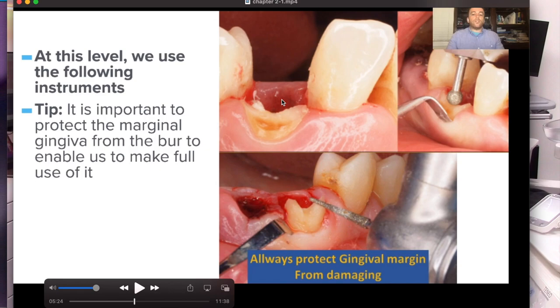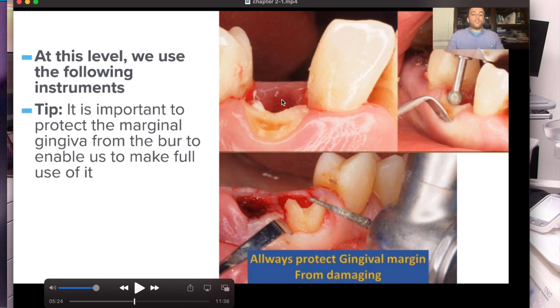If you don't know what partial extraction therapy is, essentially it involves partially extracting teeth, leaving the buccal plate — leaving the buccal portion of the tooth — and then placing your implant. In this video, he goes through a lot of the different, more detailed techniques and things to think about as you plan this.